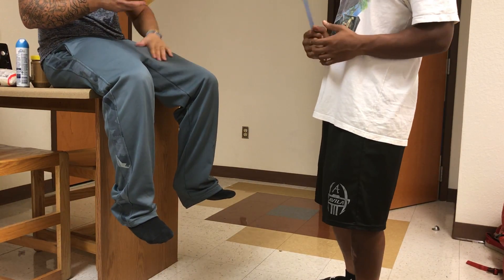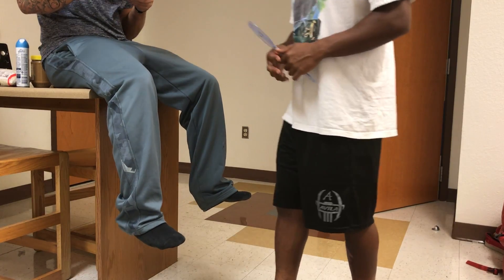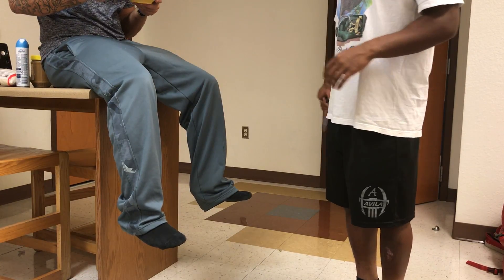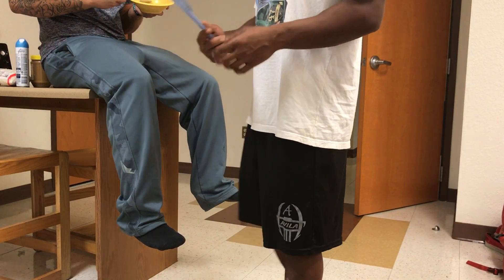In this video, we're measuring internal hip rotation. We're going to have our patient sit on a table or a counter, making sure that their legs are dangling with no space underneath them — realistically sitting at about a 90 degree angle.